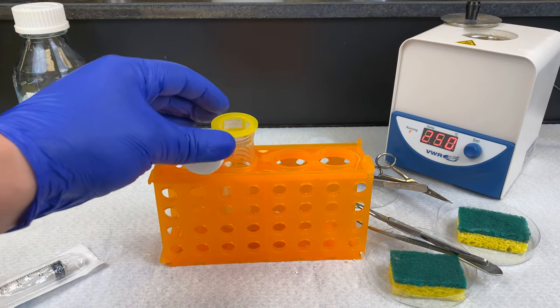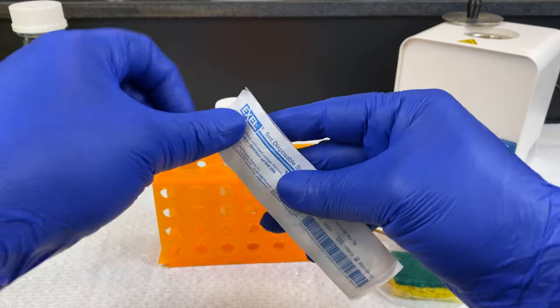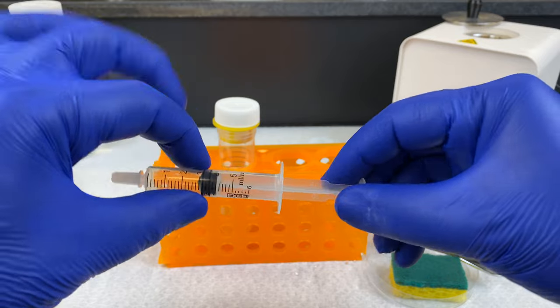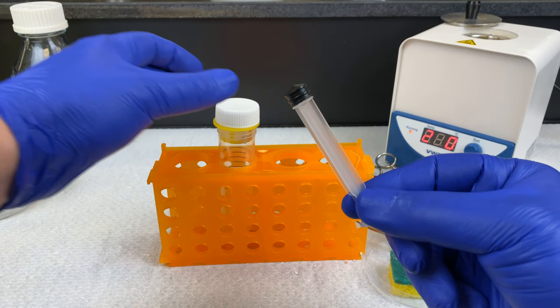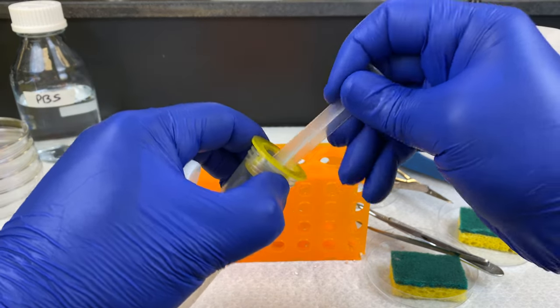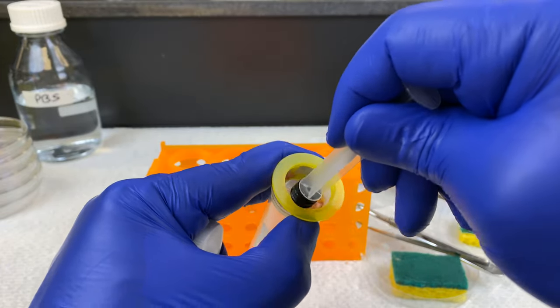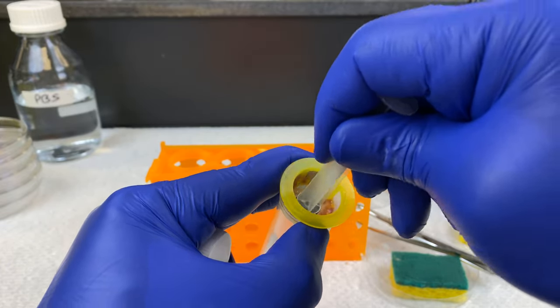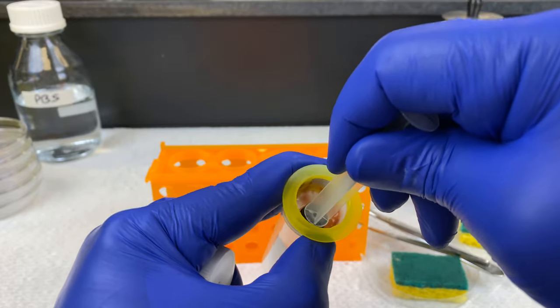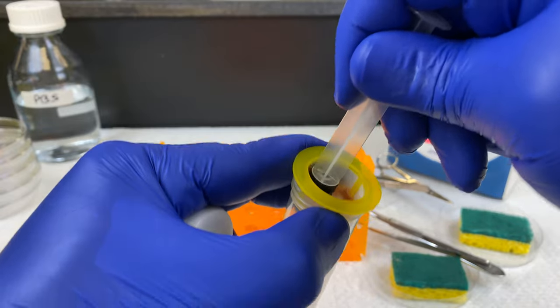Let's continue on with our mechanical disaggregation. We're going to use the plunger of this 5-mil syringe to press the tissue through the cell strainer. This is sterile, and I will use the rubber plunger to press it through. You won't see the tissue go through, but the cells will be going through. Some cells will be damaged in this process, which is why it's best to use soft organs. Skeletal muscle does not work well with mechanical disaggregation.